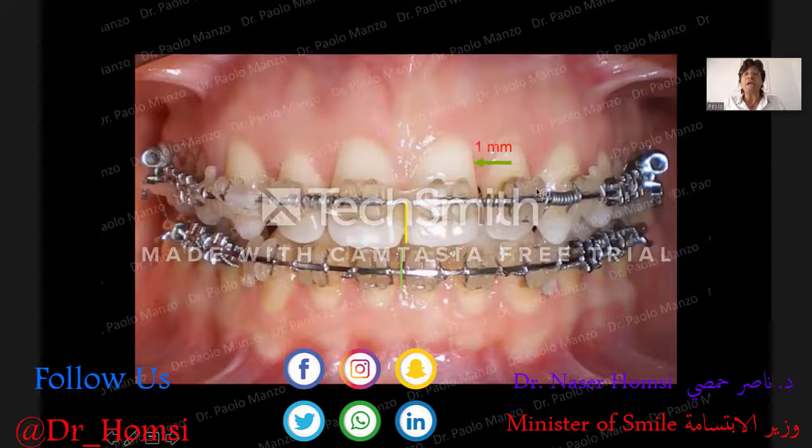And I can use an active coil spring. But what happens if the patient misses 1, 2, 3 appointments? It happens in my experience. And it can be very dangerous because the patient can be overcorrected, so more than we expect. So for this patient, I usually cut a passive coil spring 1 millimeter from the bracket. So I can move the lateral incisor and also the lateral incisor bracket only 1 millimeter, no more.